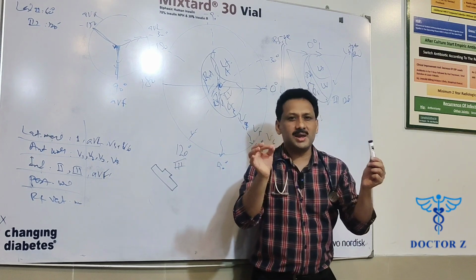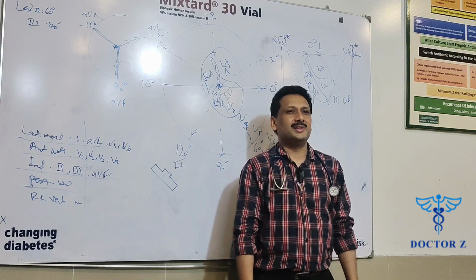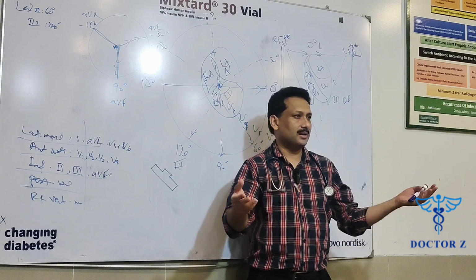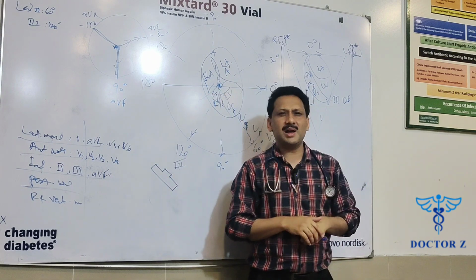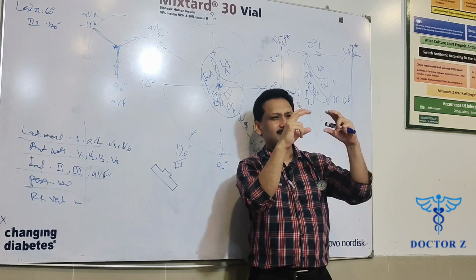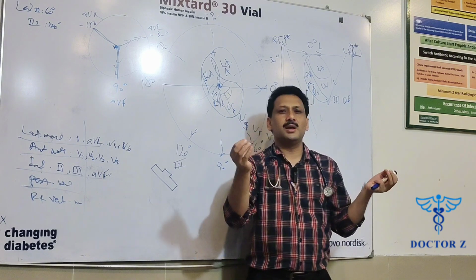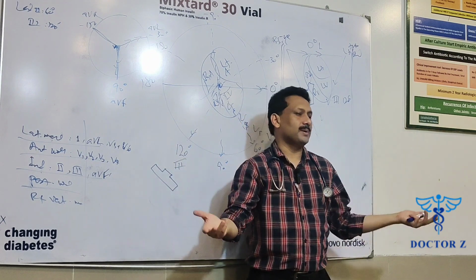Now if ever somebody asks you, can you tell me that this person is having lateral wall myocardial infarction? It won't take a second. You would just be focusing on lead 1, AVL, V5, V6. Somebody asks you, I'm having a suspicion after seeing this ECG that this person is having changes in the inferior wall, anginal changes. So you will be focusing on leads 2, 3, AVF, simple.